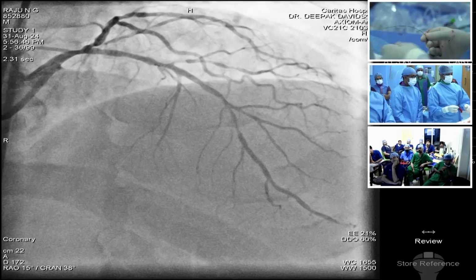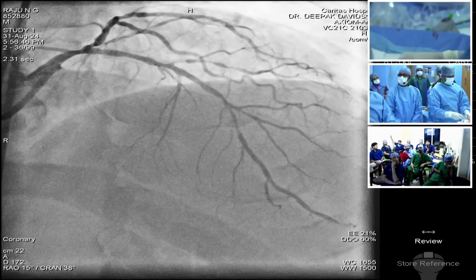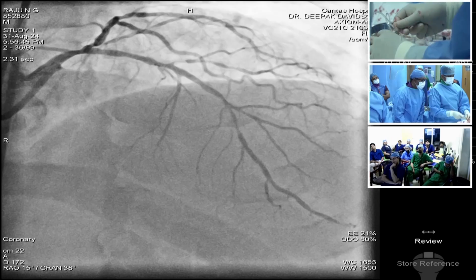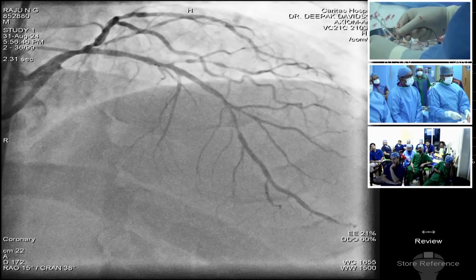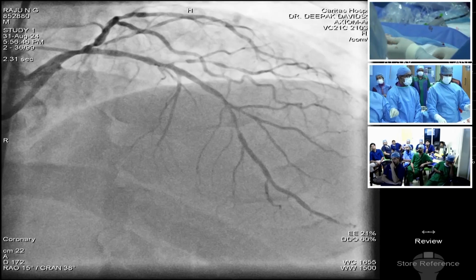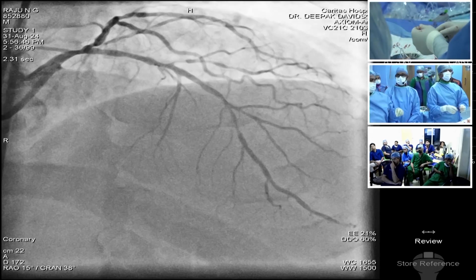For distal, only a balloon-based strategy is enough, sir, rather than going in for orbital. Yes, sir. So one thing, Vishnu, shall we just wire that without the microcatheter, use a 2.5 millimeter balloon, dilate it, and see if it dilates? Probably we can avoid orbital. Yes, that's what we'll do.